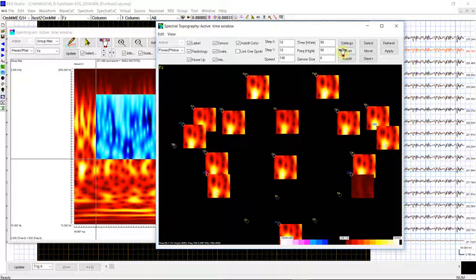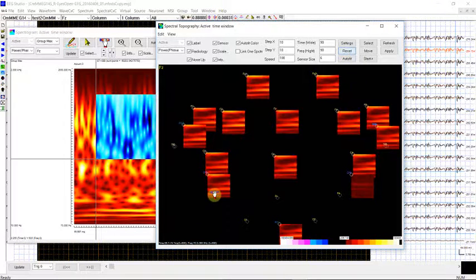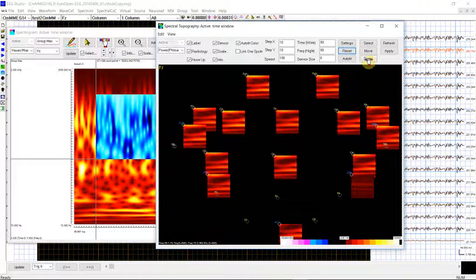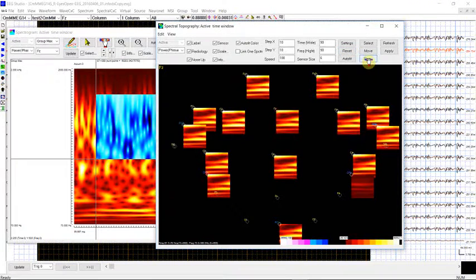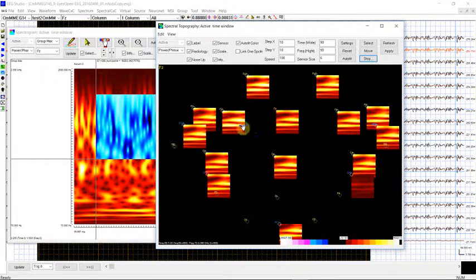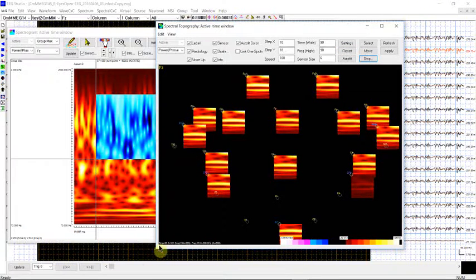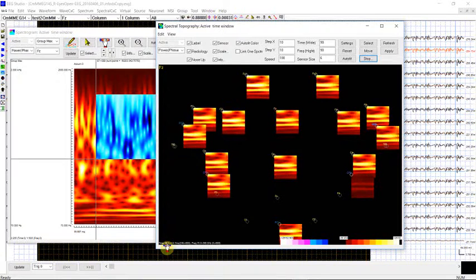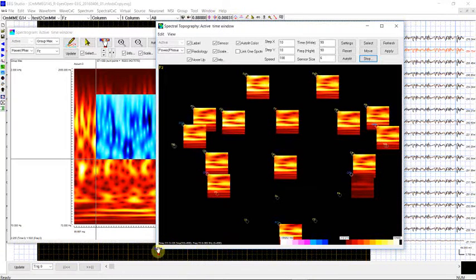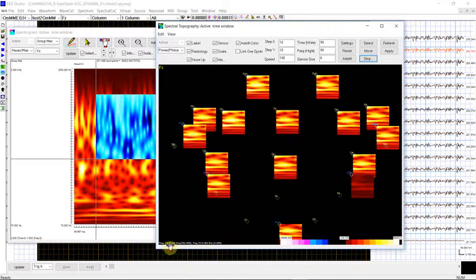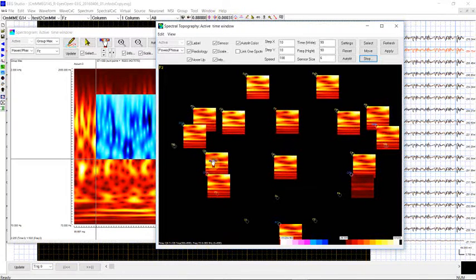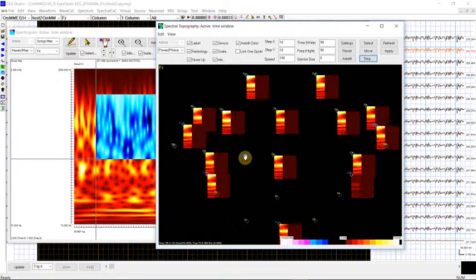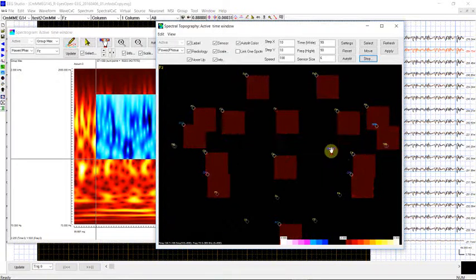Once you reset, they will return to the very beginning. If you click start moving, as you can see, they will start moving. Here is exactly which frequency range and which time window are showing in this topographic distribution.